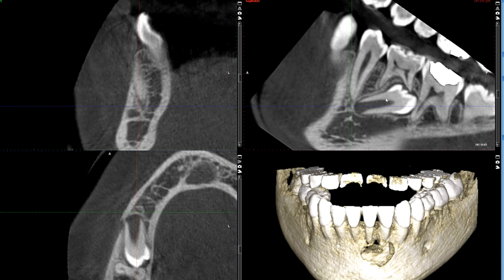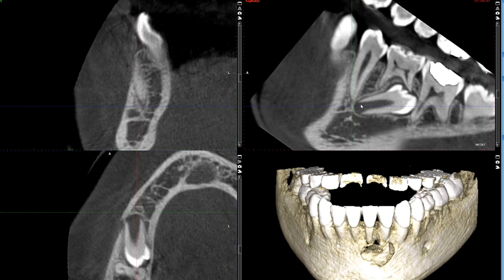Keep in mind this patient is 12 years of age and the apex is wide open. That tells me that as the root continues to develop, it may cause further resorption on this molar, or possibly even resorption on this premolar.